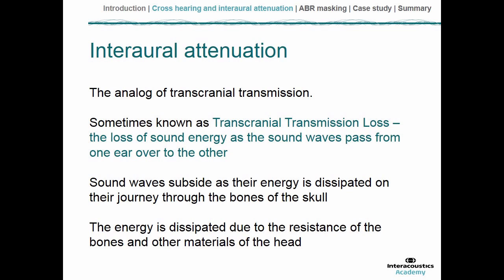Now, as these bone vibrations pass through the plates of the skull, to some extent their energy will be dissipated, and the vibrations will fade out. And this happens because the energy of the vibrations encounters the resistance of the bones and then the other material, the soft tissue of the head, and that dissipates the energy. And if the energy from vibrations on one side of the head is dissipated before those vibrations reach the other side of the head, then the sound vibrations haven't overcome the interaural attenuation.